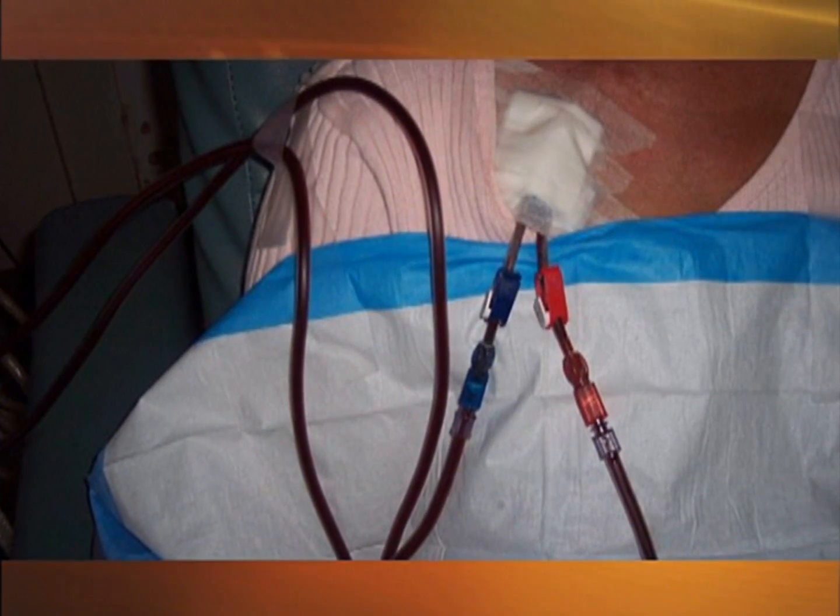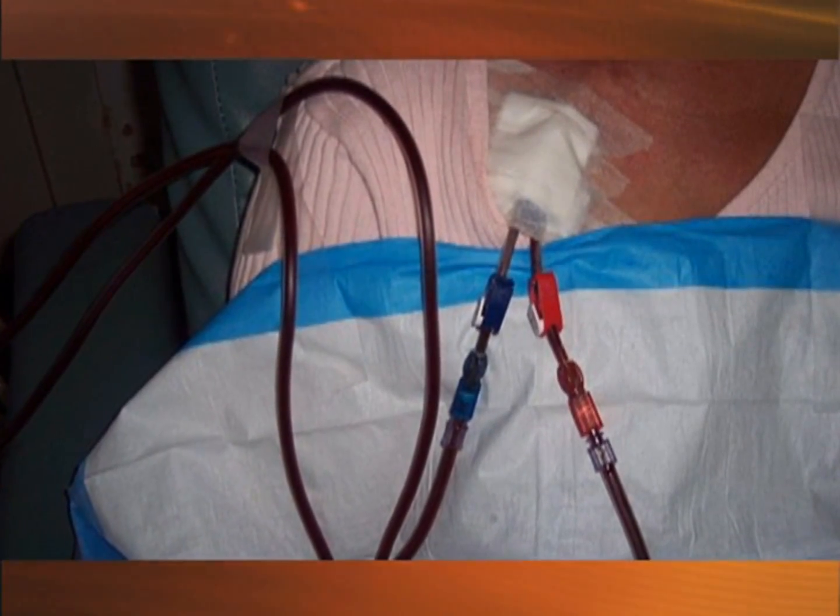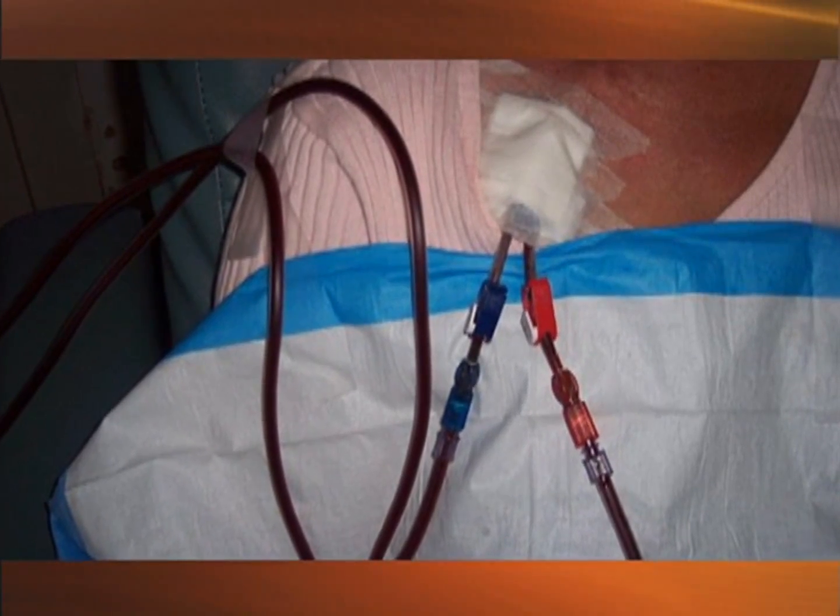A catheter is used as a last resort and is placed only when a functioning fistula or graft is not present. If a catheter is needed, it is placed in a large vein in the neck and then tunneled downwards where it finally exits in the upper chest. Catheters are not recommended for several reasons. There is a high risk of infection, a clot can form in the vein in which the catheter is placed, or the vein can narrow.